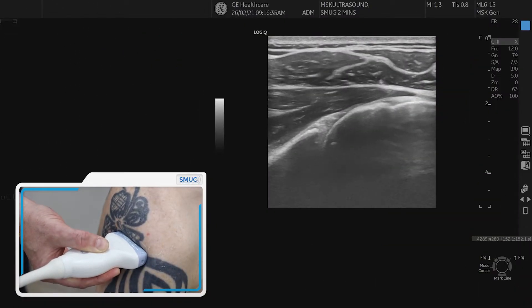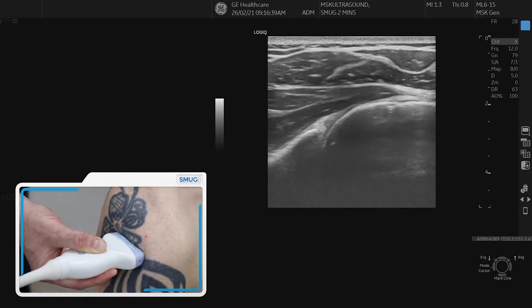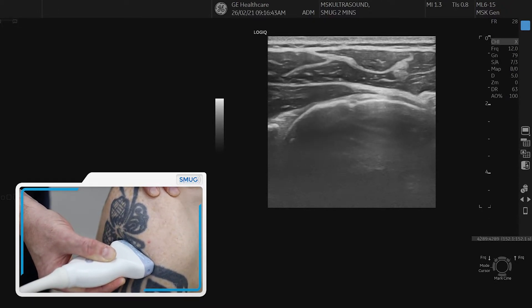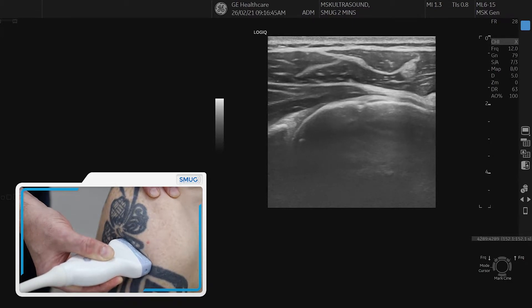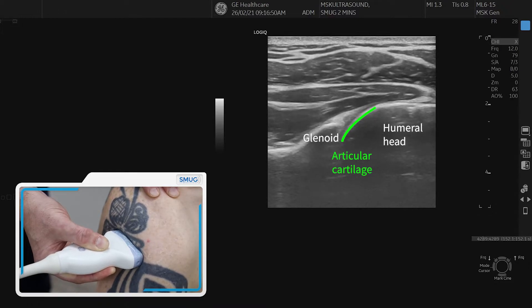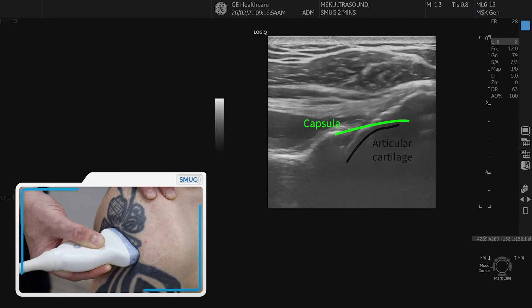We're going to show you the posterior shoulder — the posterior part of the shoulder joint. You put the probe across the top part of the humerus and then you look for the bony landmarks. The arm is on the right side, then you look for the glenoid and the labrum. If you externally rotate your arm slowly, you can confirm that you're at the joint line.